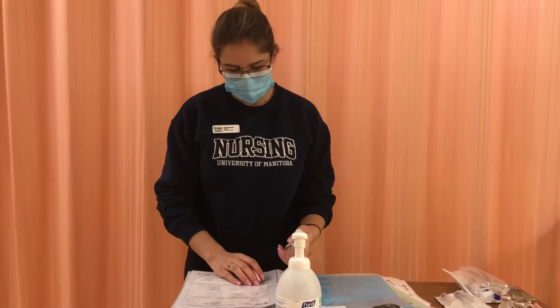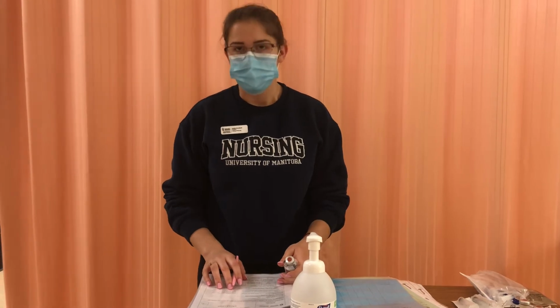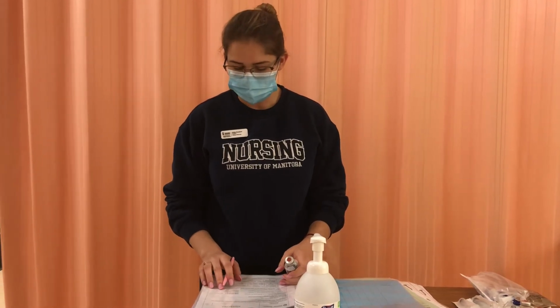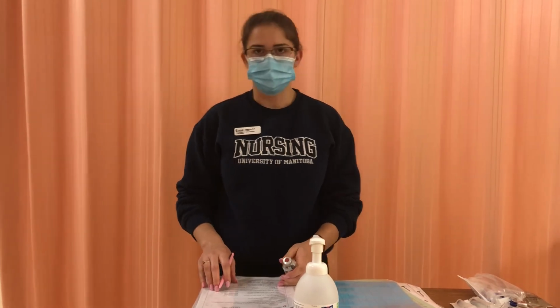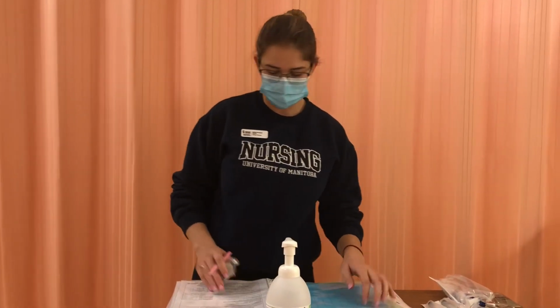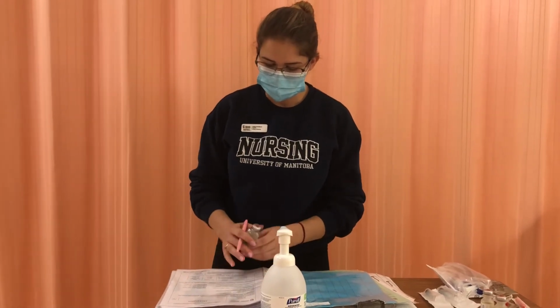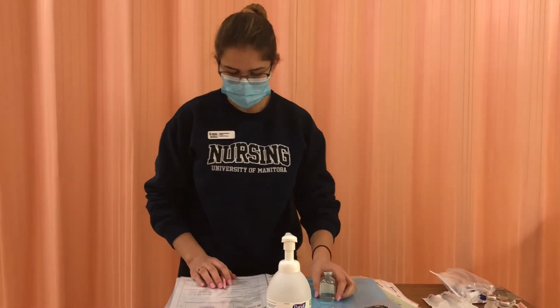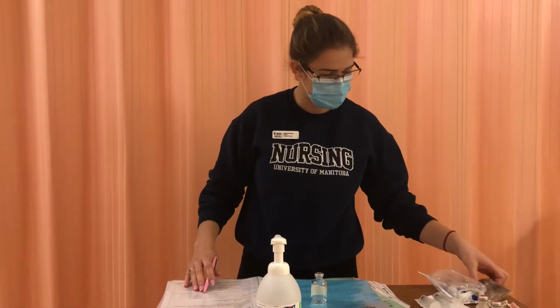I have a 2-gram vial, so I'm going to be reconstituting with 6.8 mLs of sterile water for injection. My final volume will be 8 mLs, and my final concentration will be 250 milligrams per mL. So I'm going to draw 3 mLs to get my 750 milligram dose. For a 500 milligram to 1 gram dose, I'm going to dilute it in 50 to 100 mLs of normal saline. So I've got my mini bag here.